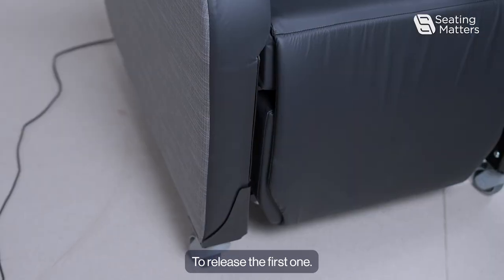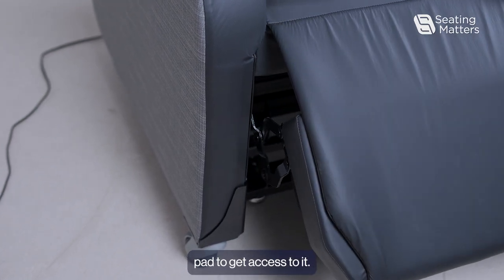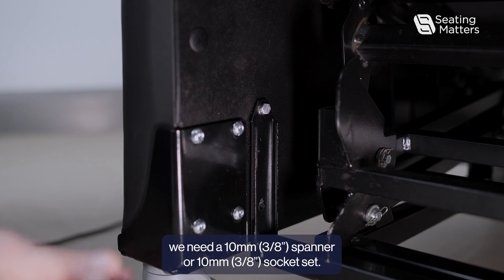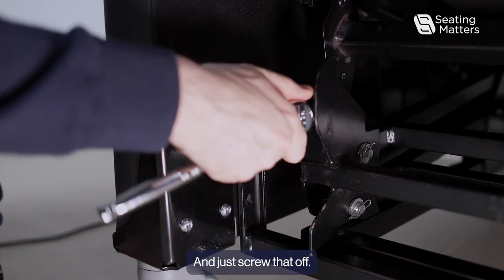To release the first bolt, it's best to elevate the calf pad to get access to it. We need a 10 millimeter spanner or 10 millimeter socket set and just screw that off.